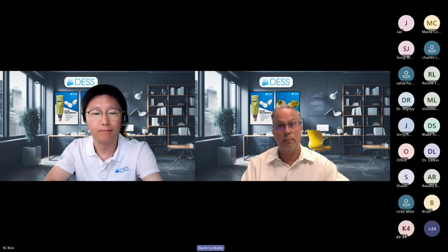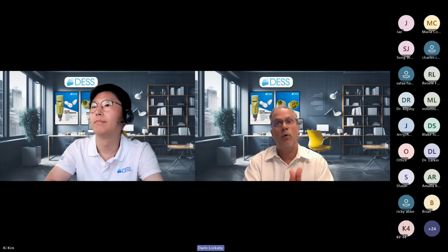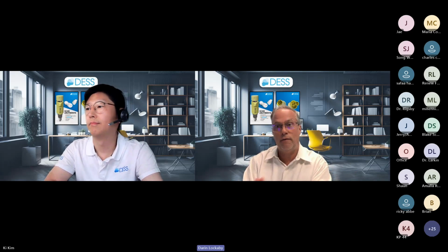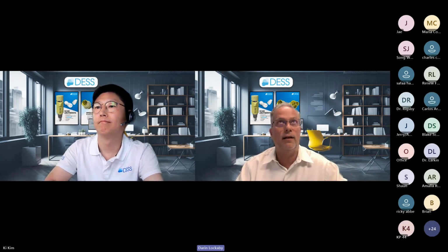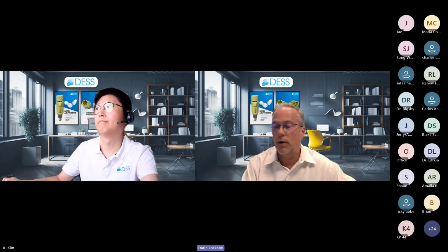It is a validated process, so it has six particular steps, and as long as you are working inside of our partner validated members in each one of those 6 steps, you basically can in a very regulatory cleared way mill your own custom abutments in-house utilizing our 510K.